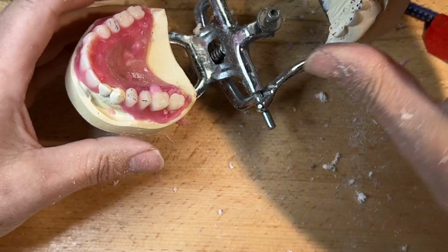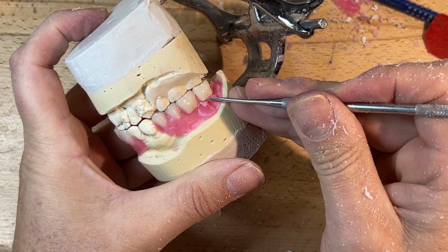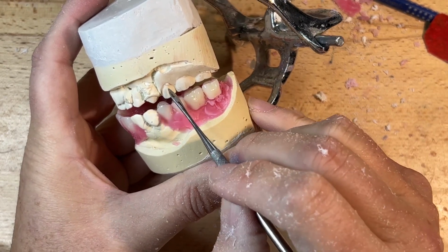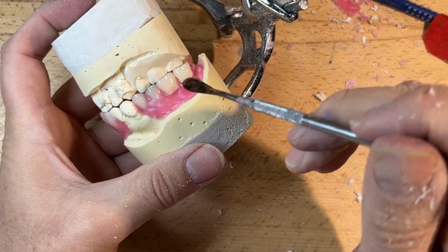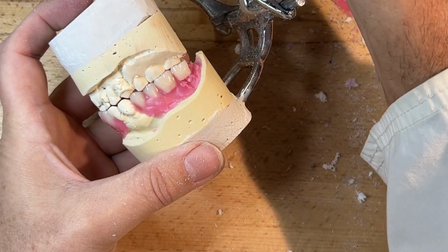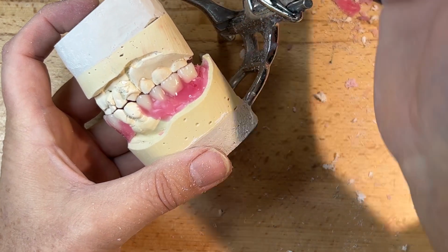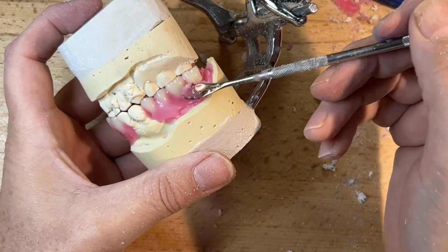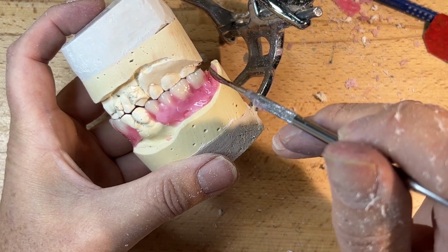And I've just widened the occlusal table of number 7 and tried to maintain the same overbite over jet. This is our biggest issue, this number 5, but I think I've accommodated it okay. And adding some wax. Gonna hold it in place and prepare for our wax up.